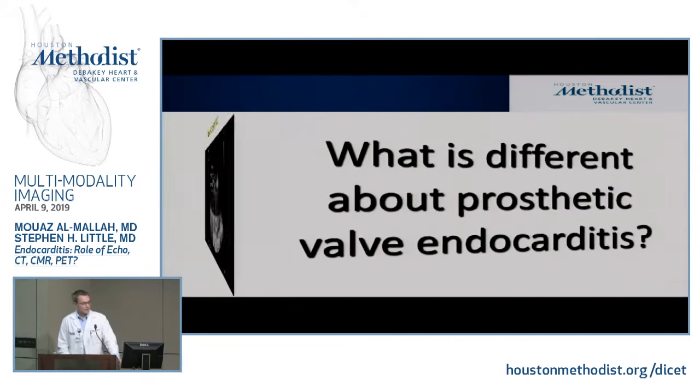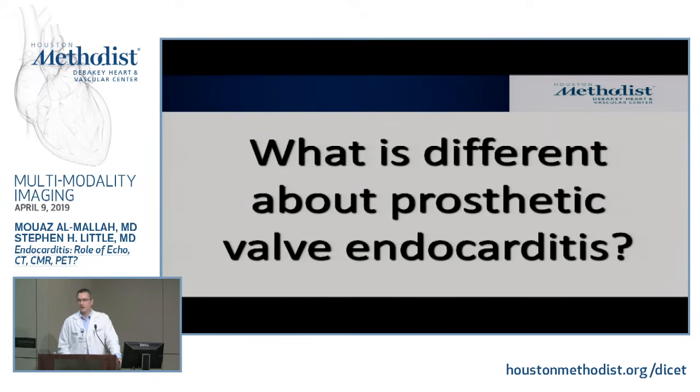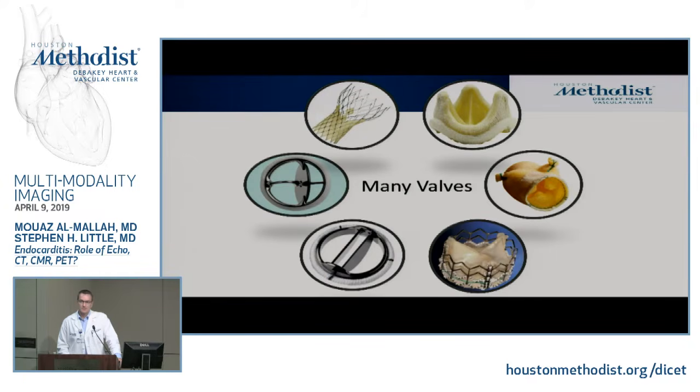But we have to remember endocarditis can actually extend beyond the heart, and if it's an inflammation of the endocardium, we still call it endocarditis. All right. So the prosthetic valve realm is tough, we have lectures just on this alone, recognizing the quantitation. The real reason that this really matters is because there's so much prosthetic material. Sometimes you get endocarditis on the prosthetic leaflets. Sometimes you get it on the sew rings.